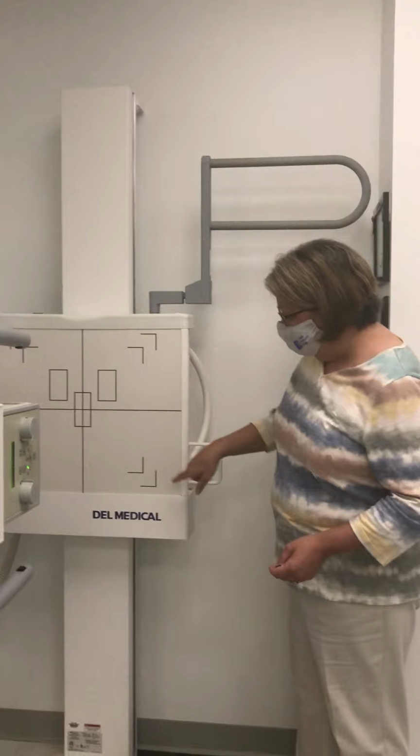Sir? Hi, my name is Rebecca. I'm going to be getting an image of your abdomen today at my board. Can I have your full name, please? Benjamin Hamill. And your date of birth? 1892. Thank you so much. Please stand with your back against this board.